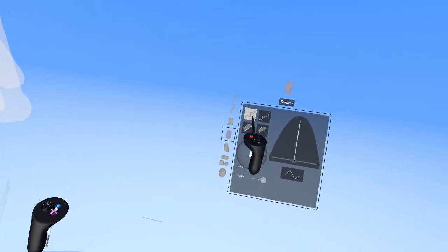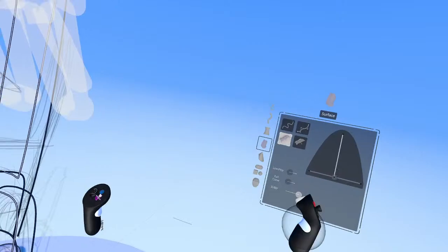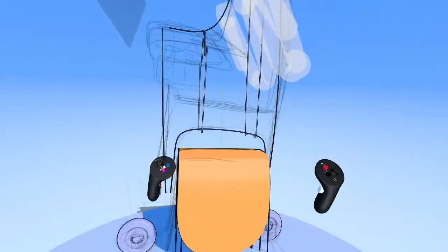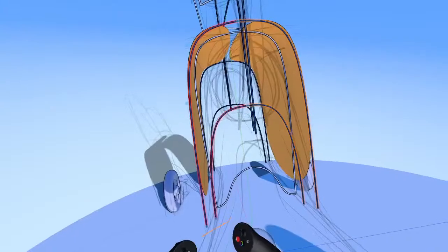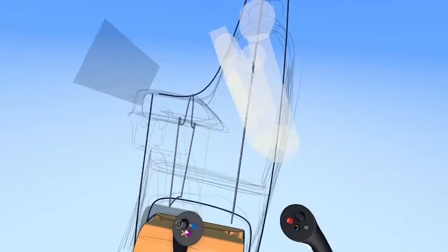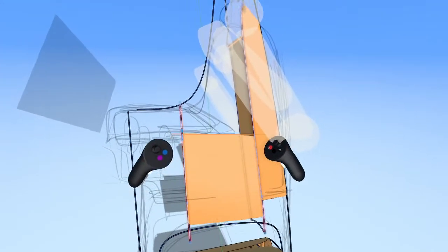And the last thing we're going to do is go from this mixed input mode and select bridge curves. Just like the name suggests, we're going to be able to bridge a surface between the curves. So let's change our surface data to be a different color, and select two curves and create a surface between them. So right there, we're using that for the base. Let's use it for the inner part right here. And over there. And let's try using that here. We can make a shape right here. And yeah, let's make a shape over here.